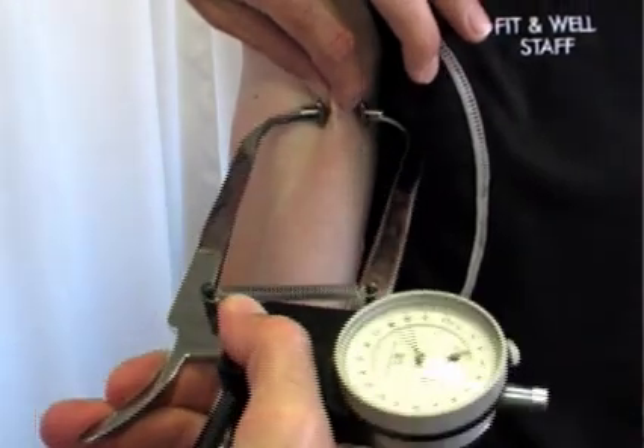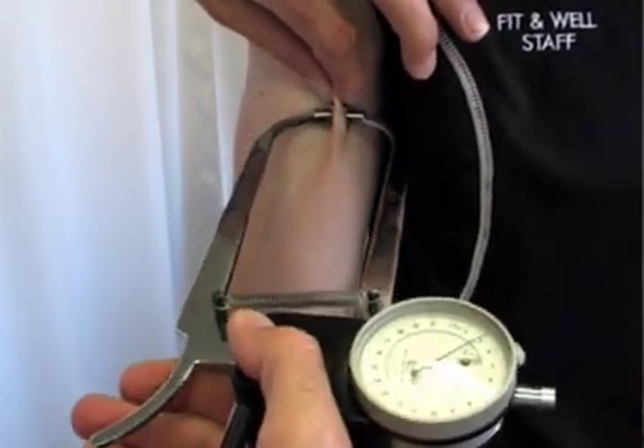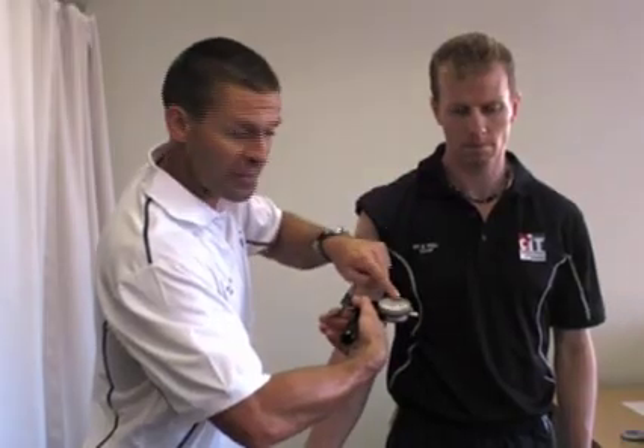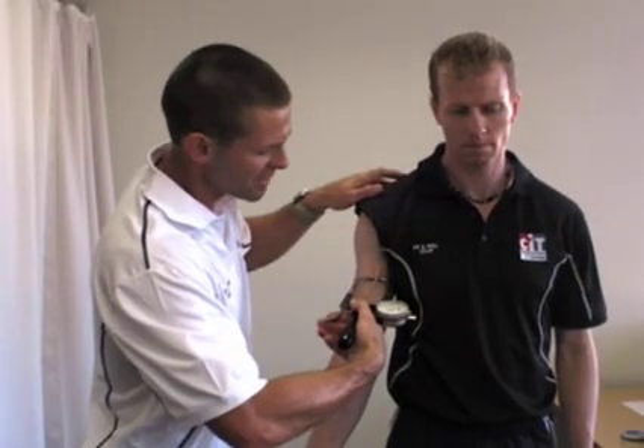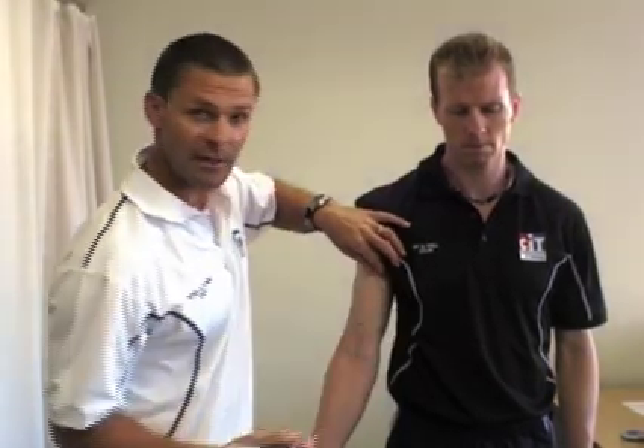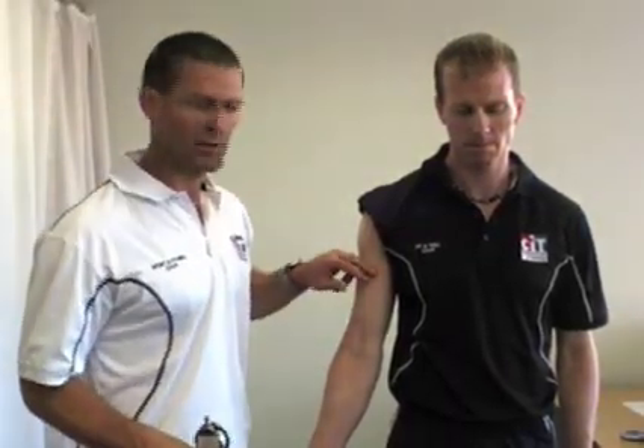We simply grab the skin, take the skinfold calipers on that point, take a hand away, and get a reading. For today, Simon's bicep skinfold is 3mm. Then simply release it. I always give it a bit of a rub because it makes it feel a little bit better.